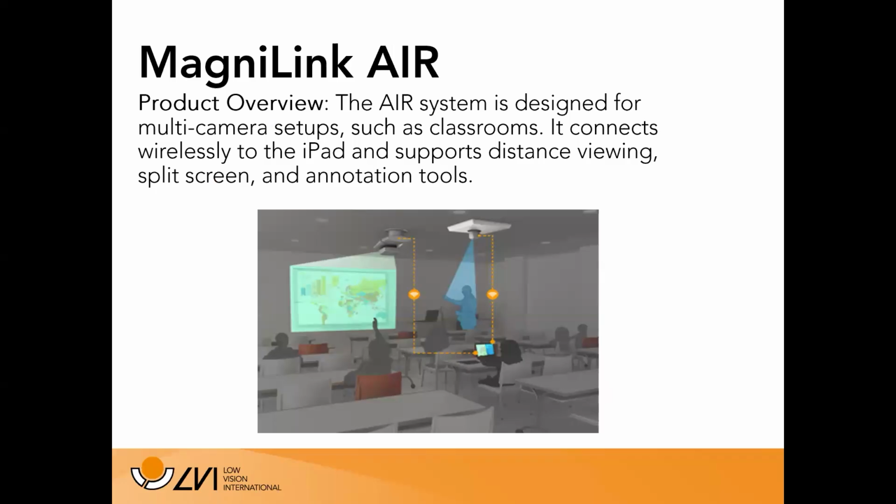And so we've talked about the Magnilink iTab with that stand, and then we talked about the Magnilink Mini, the Magnilink S, and the Magnilink Pro. The fifth group of products that I want to talk about that will work with iPads is from our Magnilink Air series. I don't have nearly enough time to do this particular product group justice. However, we do have extended webinars that talk about this system in detail. I do want to highlight a couple of different products within this group that people commonly use with iPads.